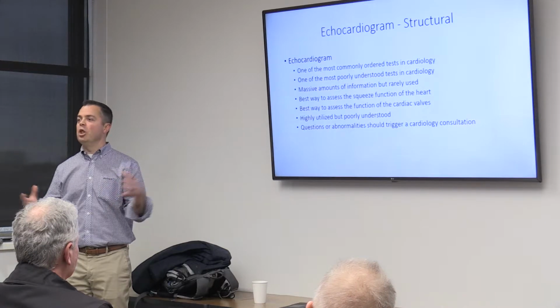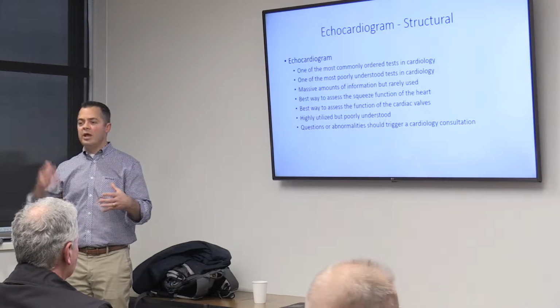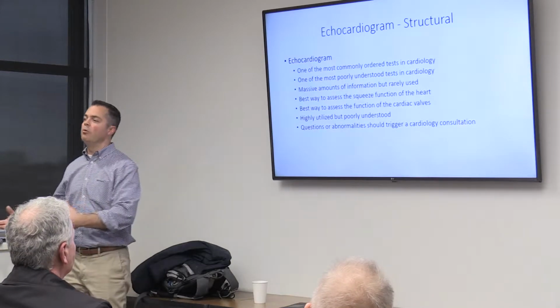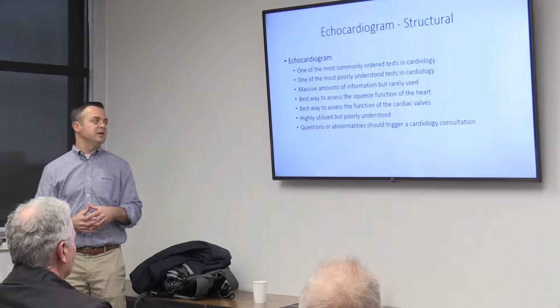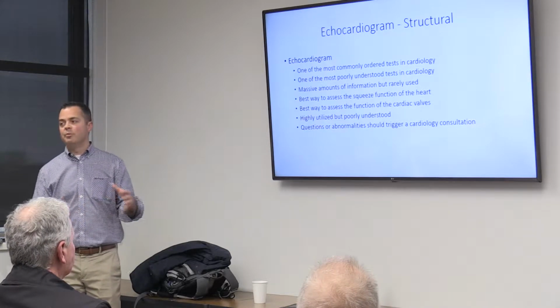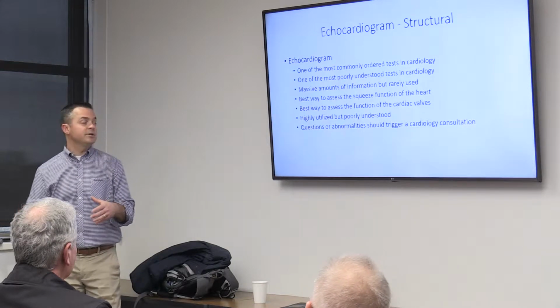And that's just the amount of blood that gets ejected with each heartbeat, okay? And we have a normal range and an abnormal range. And so that's a numeric piece of data that comes from this test. It's very important. It's useful for making diagnosis. It's also useful prognostically.